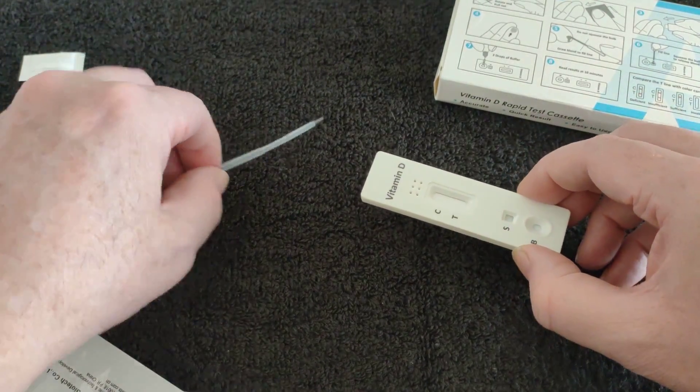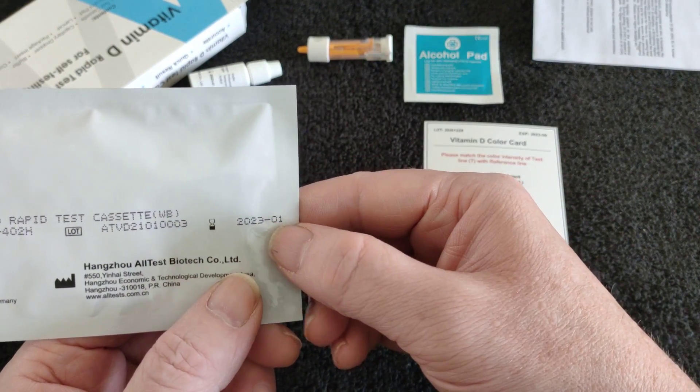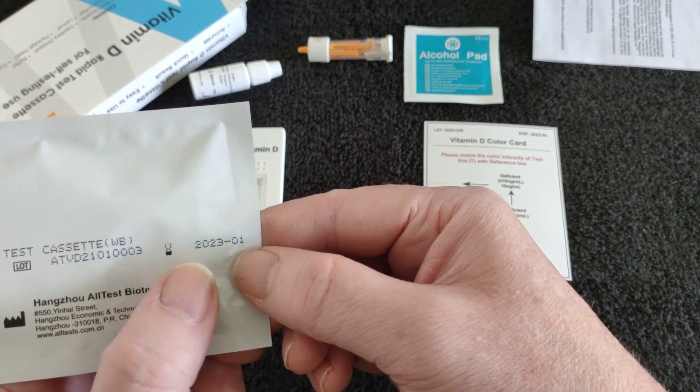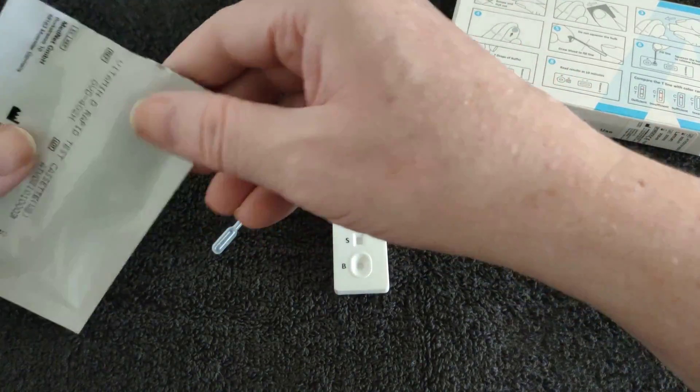So it's got two things of importance. That's the actual cassette test — it's got a use-by date there. I would say from purchase to that date it would be about nine months. That's just a silicon thing.